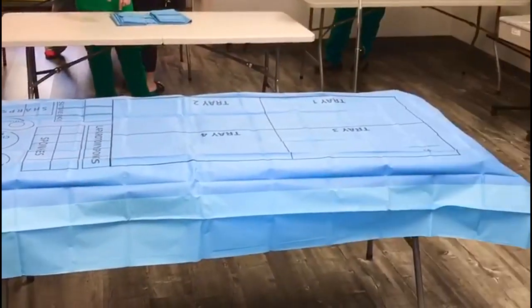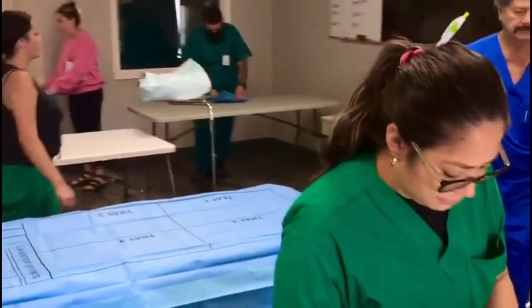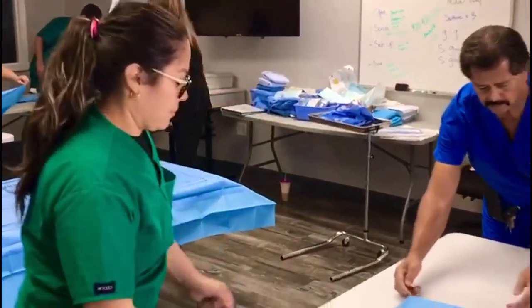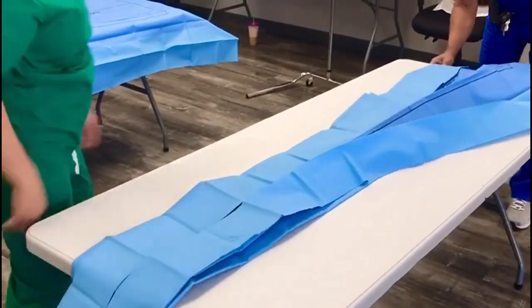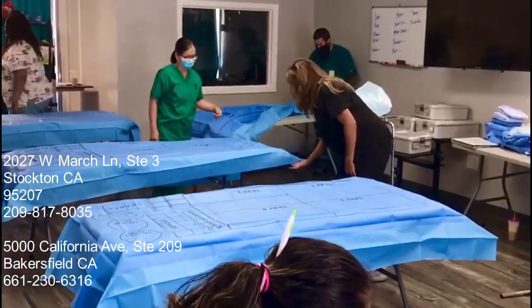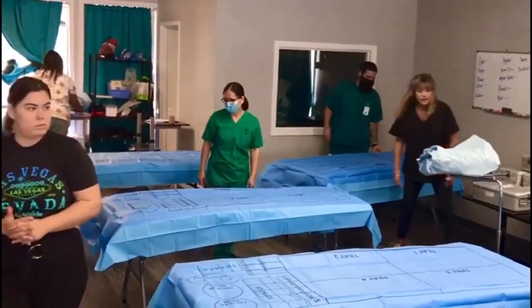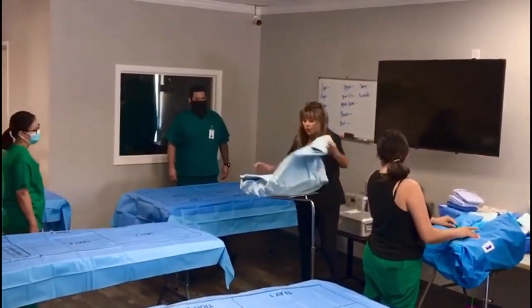Super easy, right? We know we've established our sterile area. Now we're going to go ahead and crack open our packs. We're going to open our back table pack after we get our tables draped, everybody. So we're just opening them up — not the proper way, just open it. We're going to do those corners, just the ends. Come around; if you need to move your furniture, feel free — your furniture is going to be on wheels. What we don't want to do is shake it at all. We're just going to let it fall. That's the wind disruption, that dust, all that junk. Now we're going to head over here to our pack and open it just like we would normally open our pack on our back table.